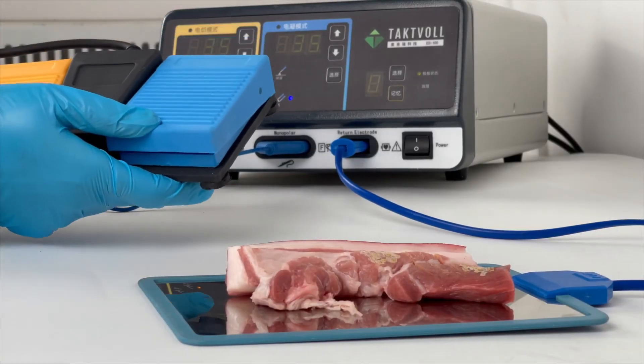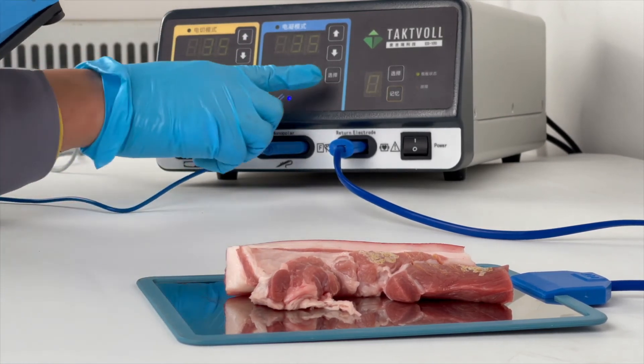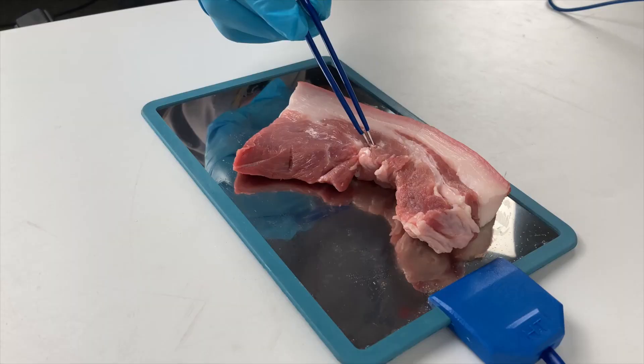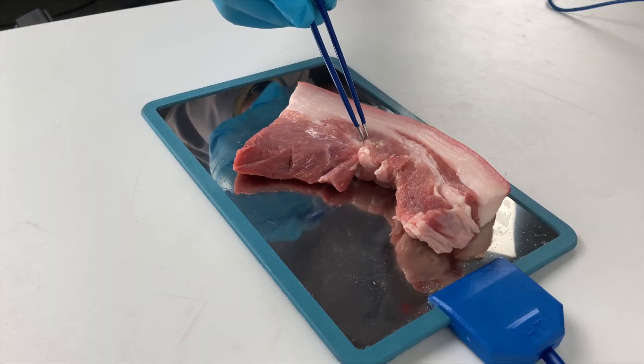Finally, we demonstrate bipolar coagulation. After selecting the mode, we use the foot switch to control it. When we step on the blue button, the bipolar coagulation indicator light will turn on and clamp the tissue for coagulation.